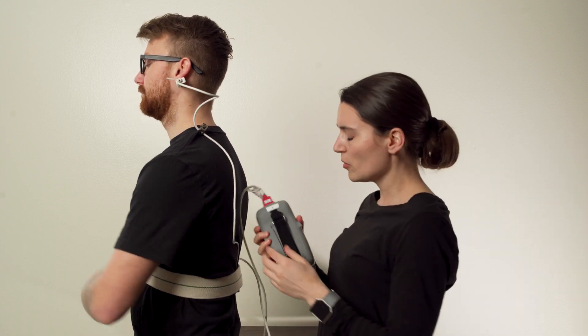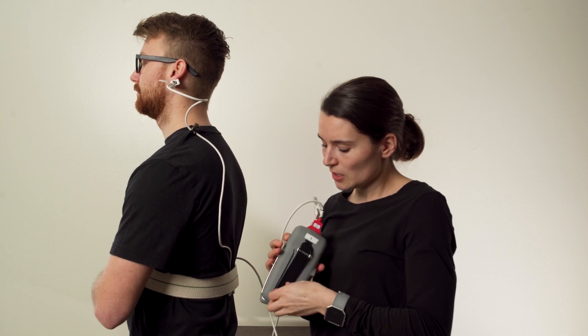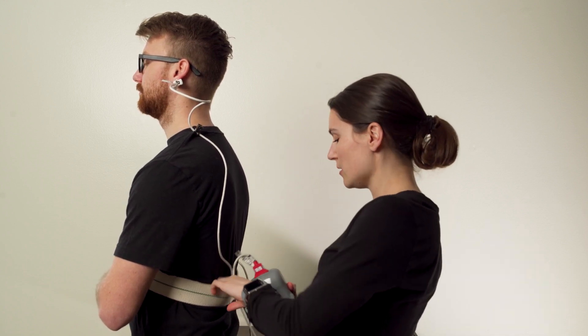Next, to attach the pulse oximeter to the patient, you'll use the strap on the back to secure it to the gate belt.